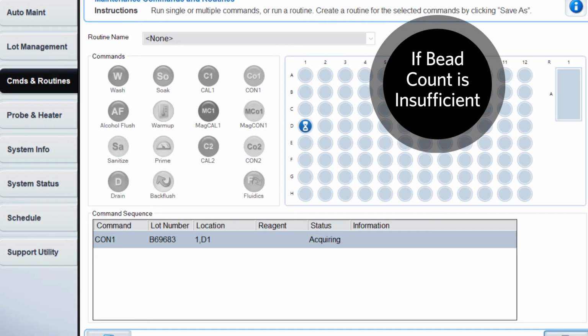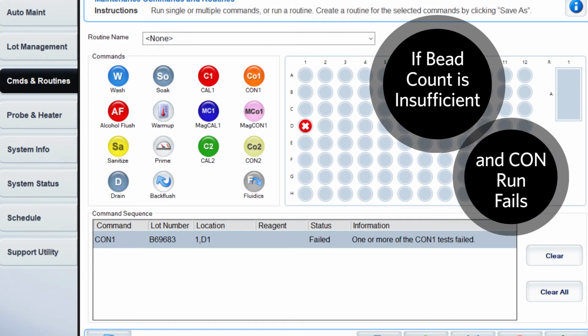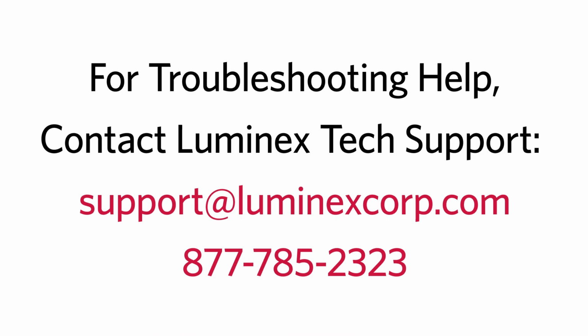If the instrument counts an insufficient number of beads and the xPONENT command fails, the issue is within the instrument, and additional troubleshooting will need to be performed. Please call Luminex Technical Support for further guidance.